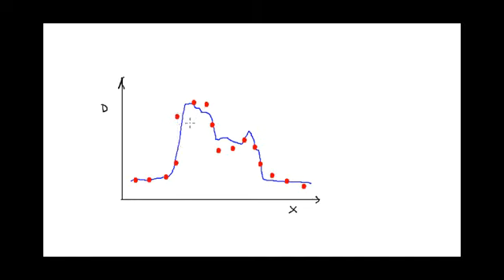So we use a special metric that combines both the deviation in the dose and the deviation in the distance. Let me start by plotting some difference in dose here. Let me say 3% would be the allowed deviation. And then in the other dimension, I'm going to show the allowed deviation in distance, 3 millimeters here. And I can draw a circle that would account for both of these. Let me just shrink this down a bit so it's more realistic, and I can move this to the first measured point.